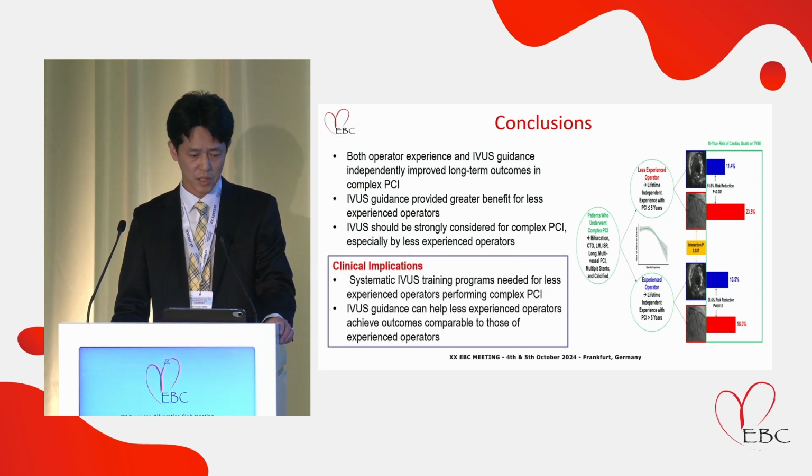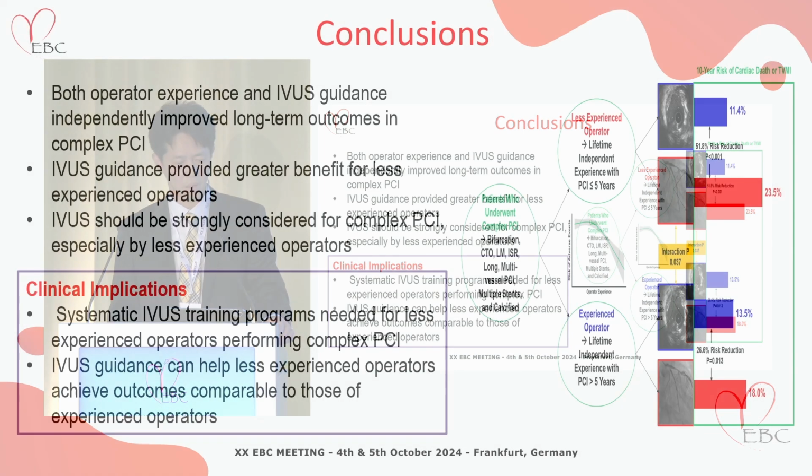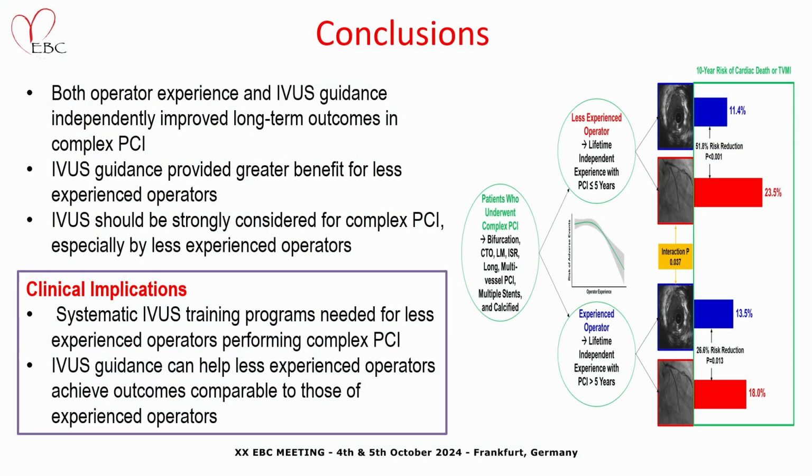The clinical implication of our study is that systematic IVUS training programs are needed for less experienced operators performing complex PCI. IVUS guidance can help less experienced operators achieve outcomes comparable to those of experienced operators. Thank you for your attention.